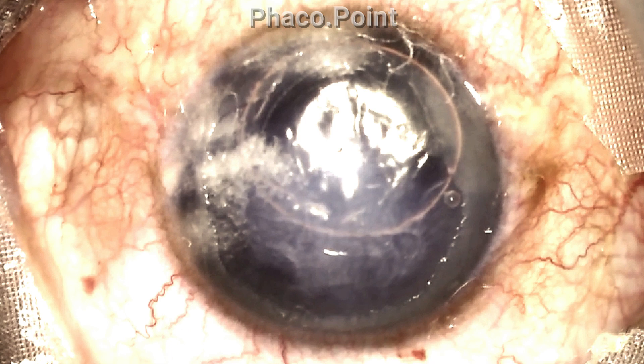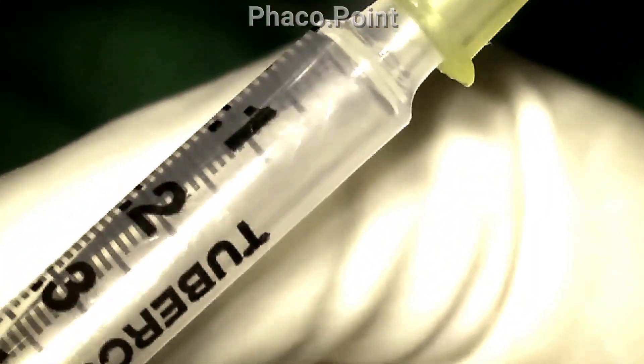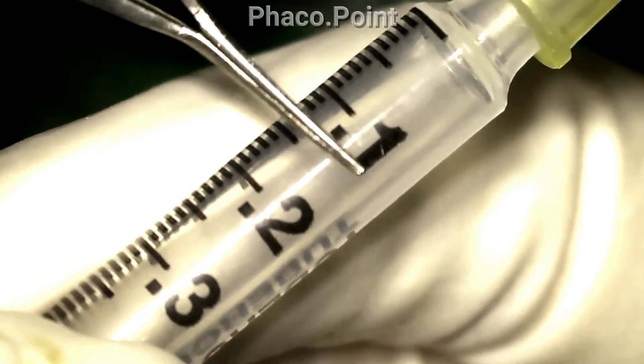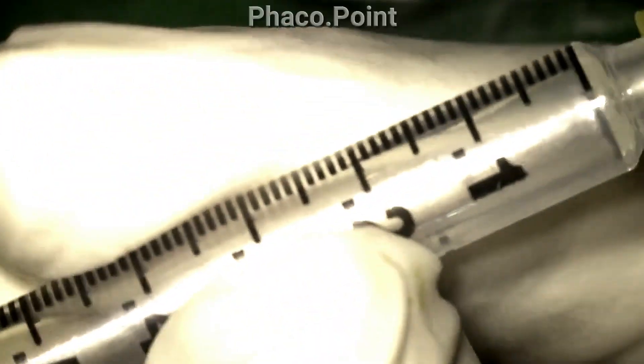Let's see how that is made. This is the C3F8 gas used by our vitreoretinal consultants. To prepare the 14% C3F8: the C3F8 is drawn out up to the 0.14 ml mark, which is demonstrated here, and the rest of the syringe up to the 1 ml mark is filled with air. This gives you the correct concentration.